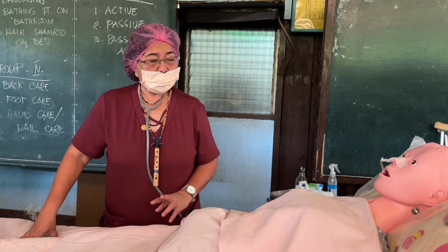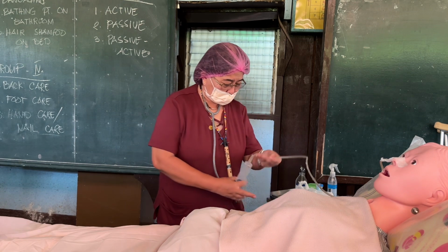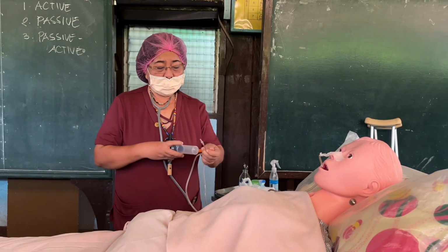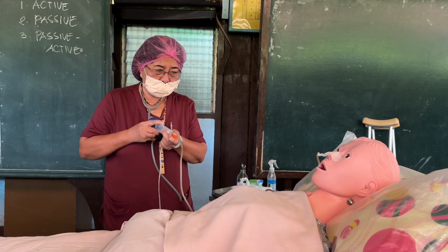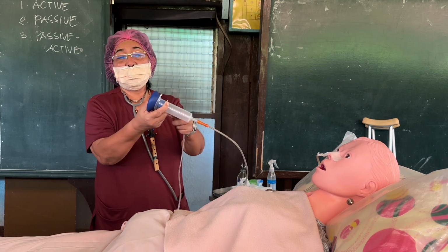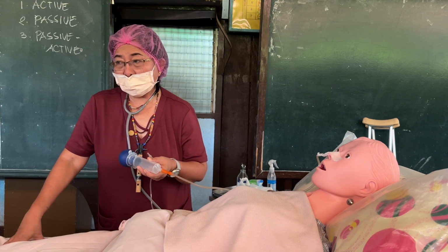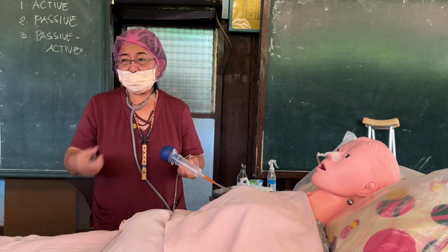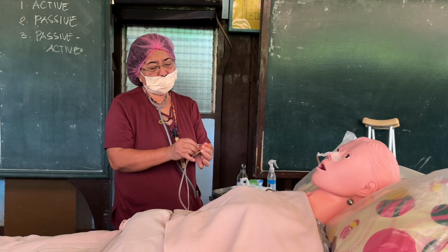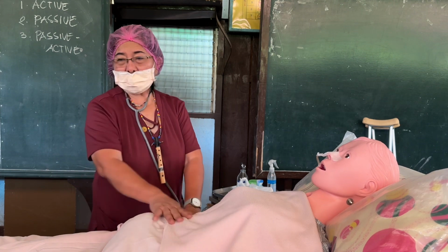Maybe it is clogged. So confirm that the tube is really in the stomach. Again make use of the asepto syringe. Remove it, insert, confirm that it is inside. Then push. If it is clogged, you suction. Then it comes out. Air comes out together with the abdominal contents, then you connect it again. It is draining. The abdomen has gone down.